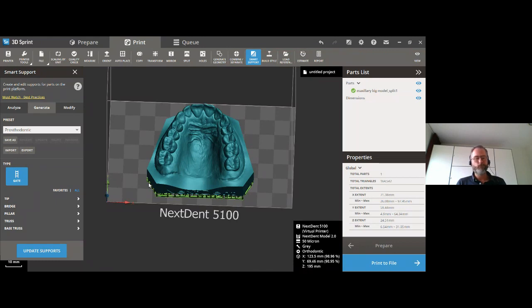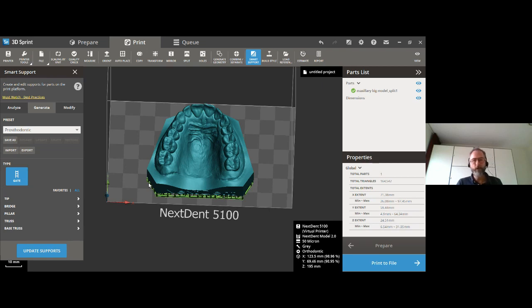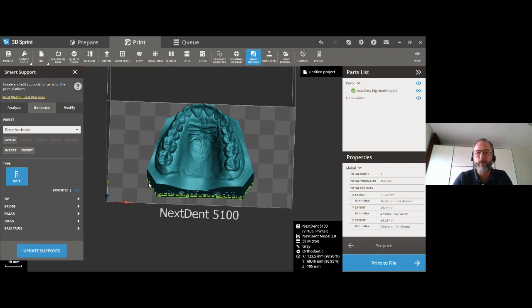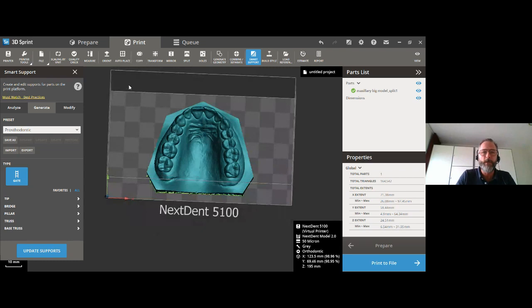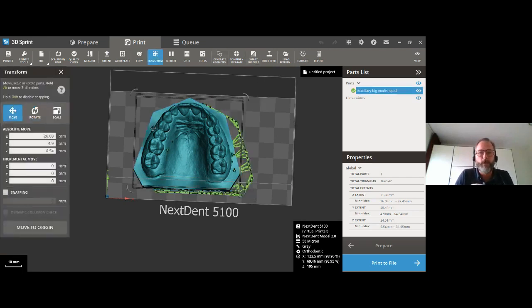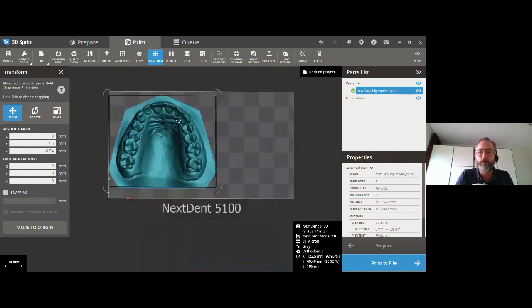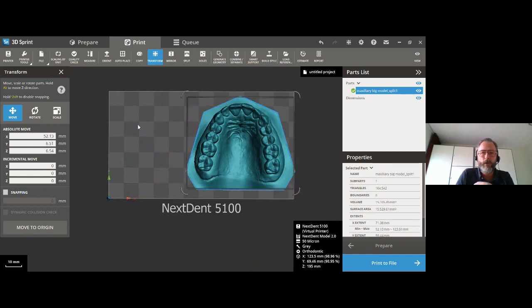Another question: is it better to place a part in the center of the build plate, or does it not matter? Many printers show a difference between center and edges, but for the Next Dent 5100 this is not the case. It's just convenient to place something in the middle, and Auto Place will place it centrally, but from a printing point of view it doesn't matter where on the platform you place the part — all parts should be the same accuracy after printing regardless of position.